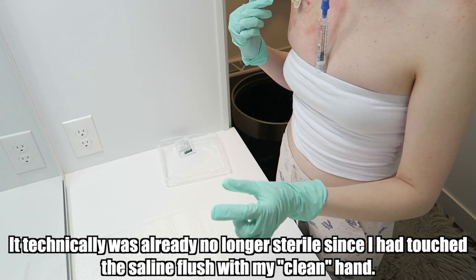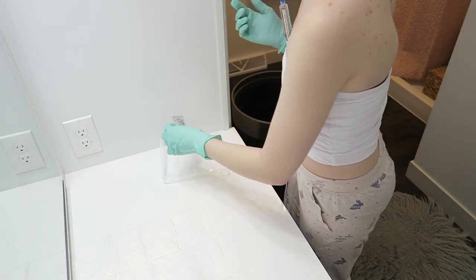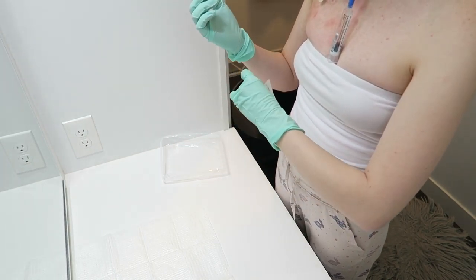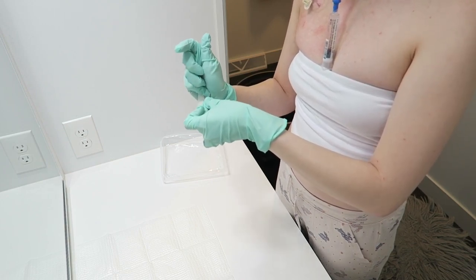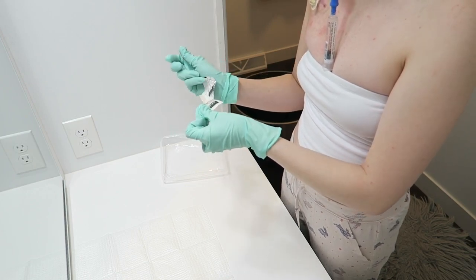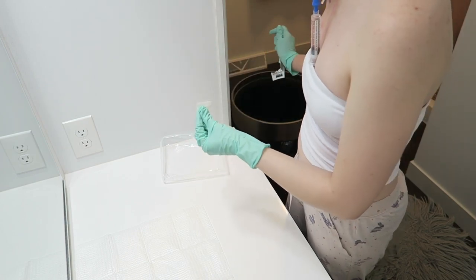So now I'm going to take my left hand, which is just the clean hand, and open my skin protector, which this part is hard. I forgot how I did it last time. I'm actually just going to open it like this. At this point, you still want to be as sterile as possible, but because the needle is already in, that is the most sterile part.